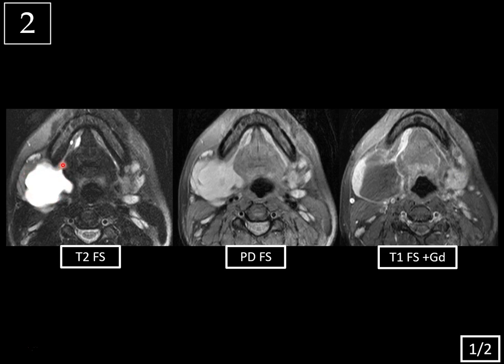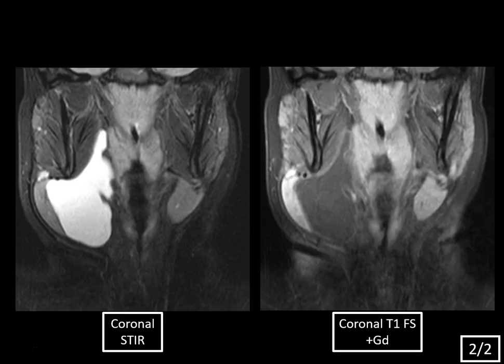Notice how this lobulated cystic mass actually has a thin communication with the sublingual space, and the cystic mass is not enhancing — it has some thin rim enhancement, but this enhancement you see here is the submandibular gland and the sublingual gland, respectively. So this is typical for a ranula, which is a retention cyst caused by sublingual gland duct obstruction. There are two types: a simple ranula, confined to the sublingual space above the mylohyoid muscle, and a diving or plunging ranula, which dives inferiorly into the submandibular space below the mylohyoid muscle. The fact that you see mass effect from the cystic mass against the submandibular gland tells us we're below the mylohyoid — this is a diving ranula, confirmed on the coronal images.